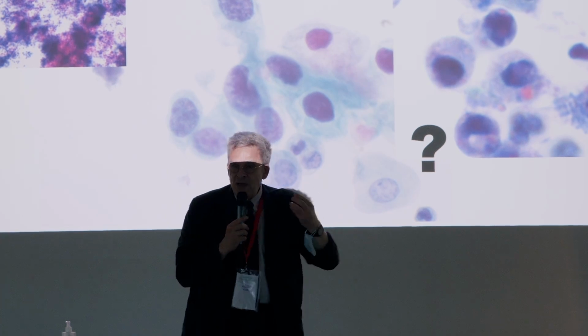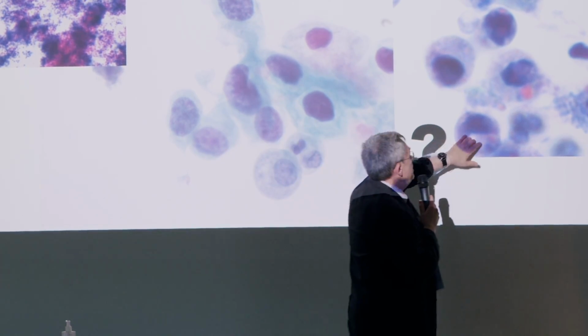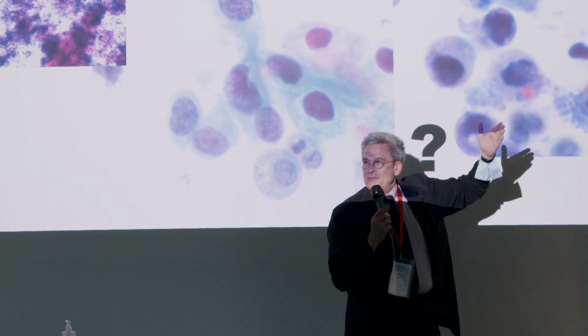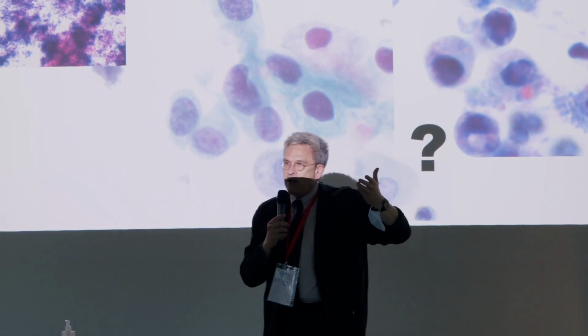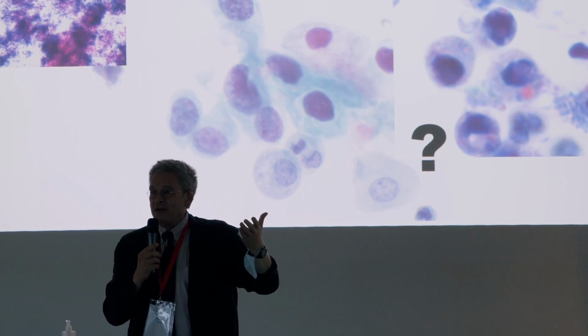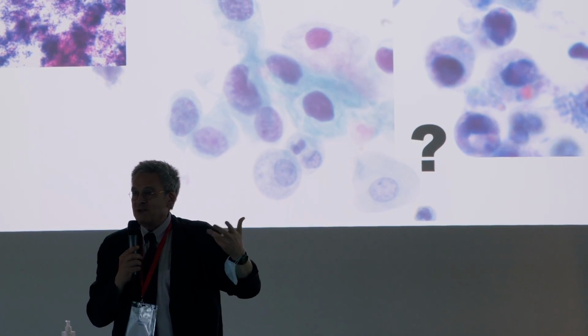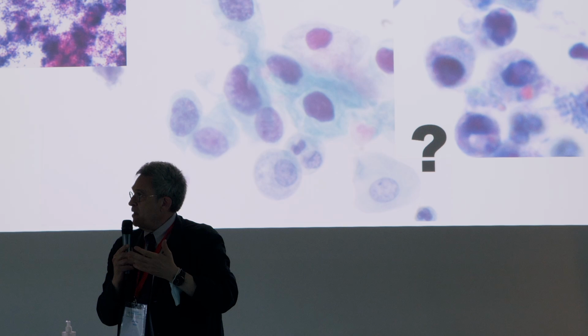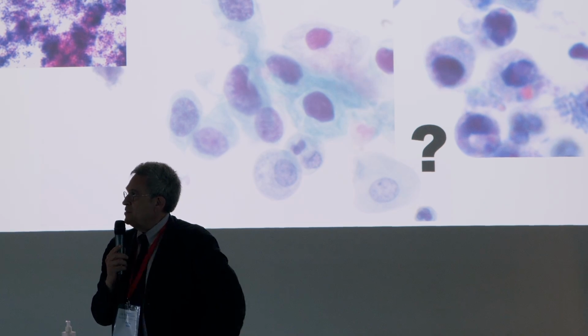Why should we have a mucinous component here and not here? So, yeah, it may be a glandular metaplasia, but then it's just a metaplasia. It doesn't mean something bad for the patient. So I would stay on the atypical urothelial cells.